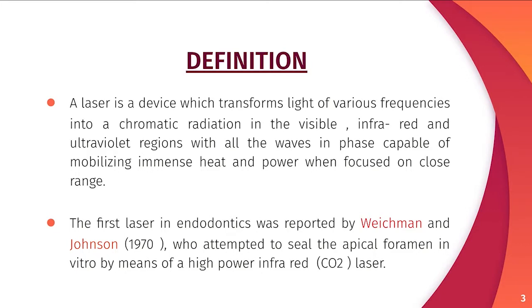The peculiarity of this radiation is that all the waves in it are in phase, and it is capable of mobilizing immense heat and power when focused at close range. Wichmann and Johnson, in an in vitro study using a high power infrared carbon dioxide laser, attempted to seal the apical foramina. This was the first reported laser use in endodontics.